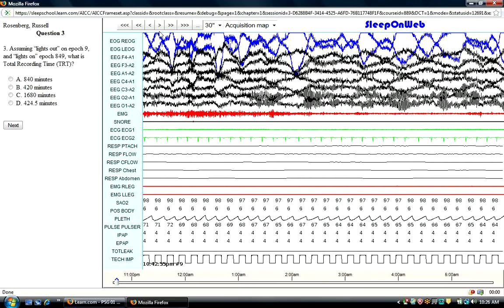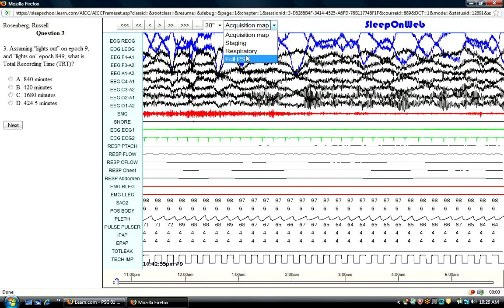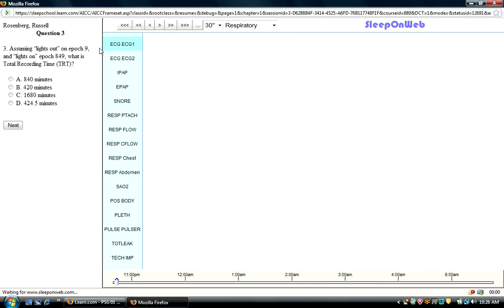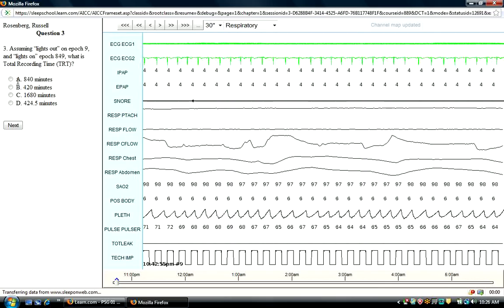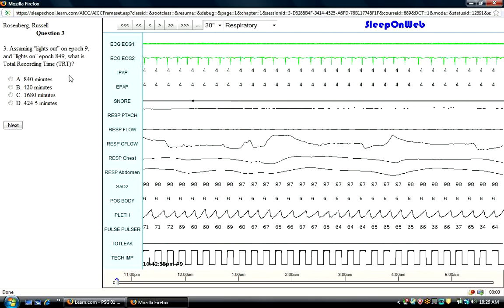So that's basically it. I've shown you the navigation bars here at the top, the time sequence that you can choose, as well as the particular montage that you'd like to use as you're viewing the PSG and as you're trying to answer the questions. Hope this helps, and thanks for checking in with WebPSG.